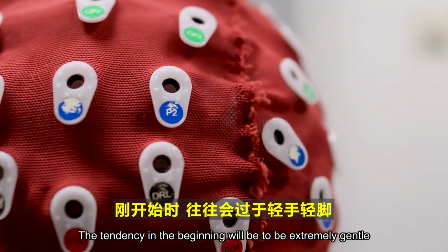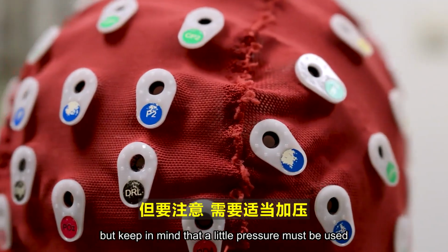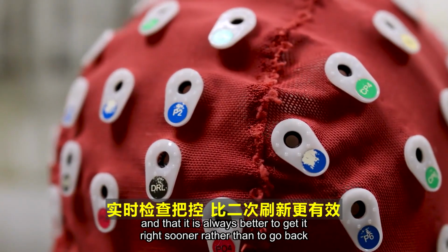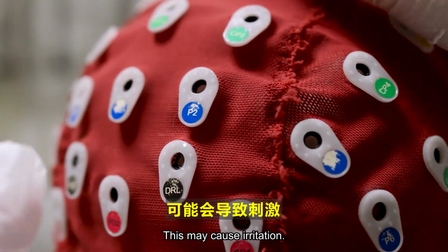The tendency in the beginning will be to be extremely gentle, but keep in mind that a little pressure must be used in order to get the desired effect, and that it is always better to get it right sooner rather than to go back and scratch the scalp again and again. This may cause irritation.